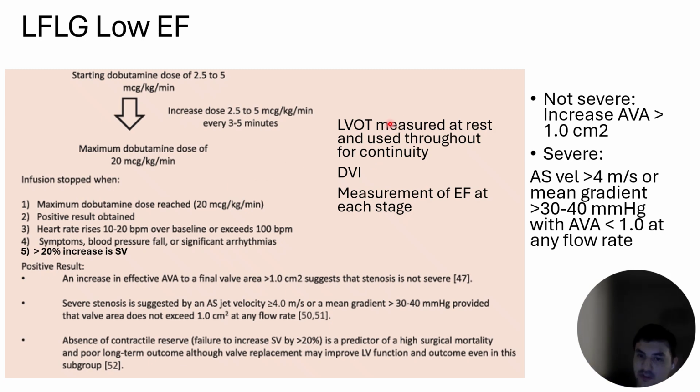By the way, the LVOT is measured at rest and used throughout the study for continuity. Why is it important? Because you just have to measure the velocity; the LVOT measurement is going to be constant there. DVI, you can use in this. Measure EF at each state.